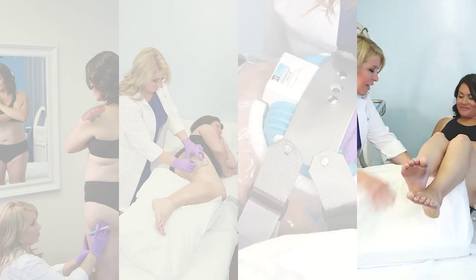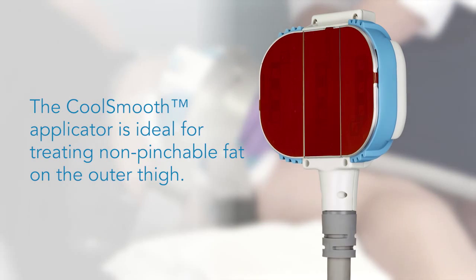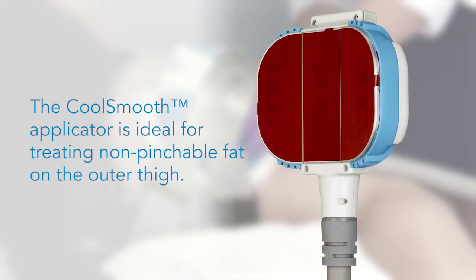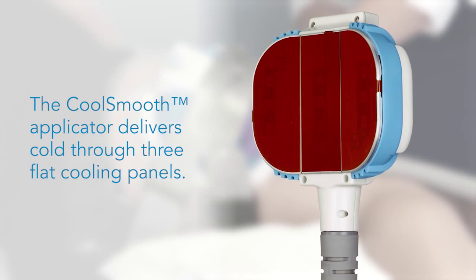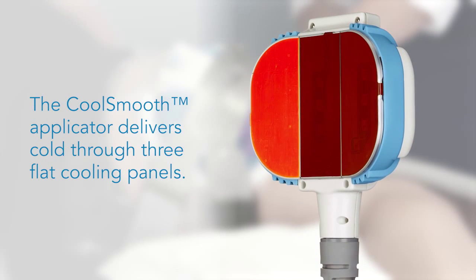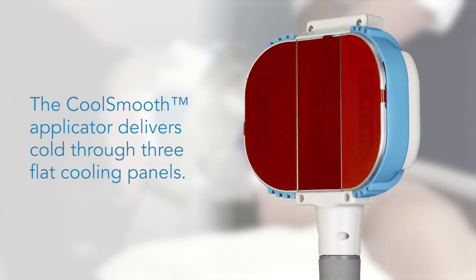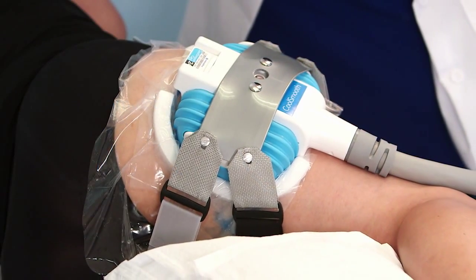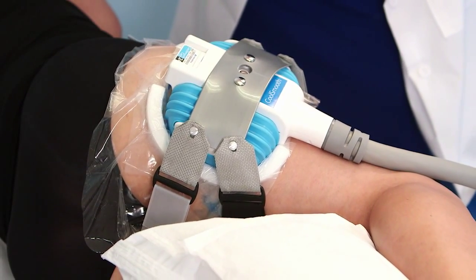For the right candidate, the CoolSmooth applicator is ideal for treating non-pinchable fat on the outer thigh. Unlike the vacuum applicators, the CoolSmooth applicator delivers cold through three flat cooling panels. During treatment, it delivers cold from the surface of the skin down to subcutaneous fat.